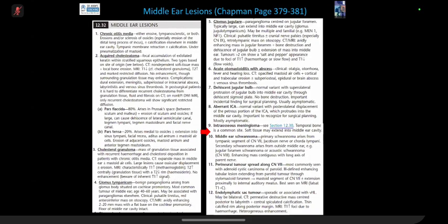Please remember that if you go back to your embryology, surrounding the head and neck, even in the upper neck, carotid sheath, etc., you can get meningioma. So that concept should be there. So mostly meningiomas in the temporal bone will be extra osseous. You will see them in the posterior fossa, and from there they will go in. But this was unique.